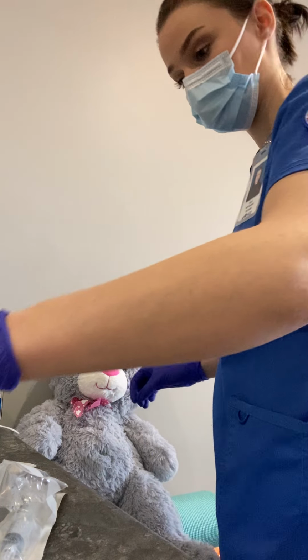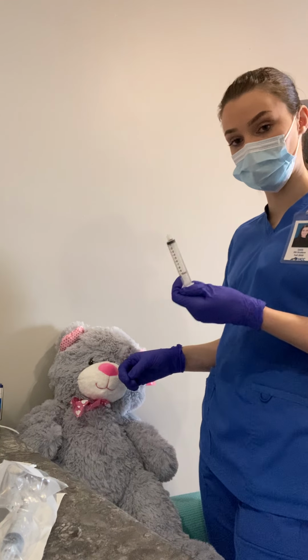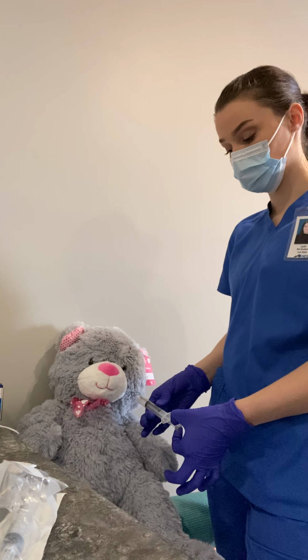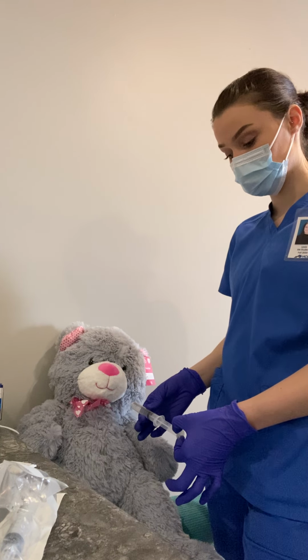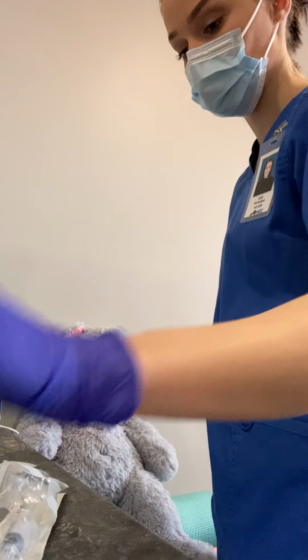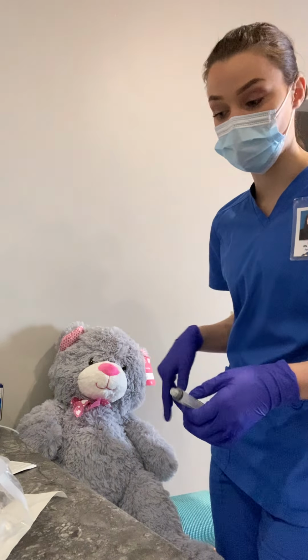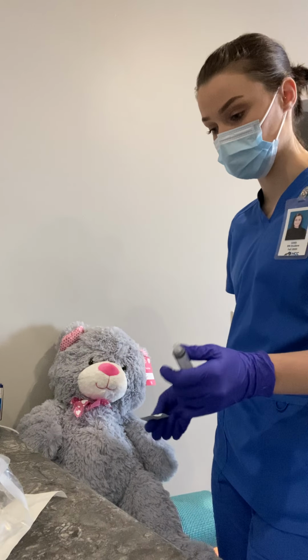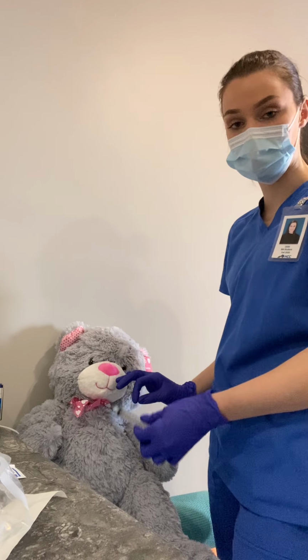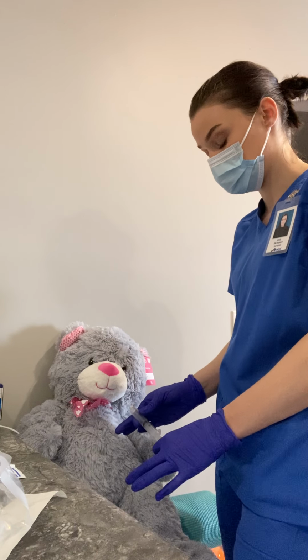Flush that. Okay. So then I'm still holding her tubing. I'm going to place my 10 ml syringe and pull back 10 milliliters of waste. All right. I've got my 10 milliliters of waste. I'm going to discard of that per my facility policy. I've got my other syringe. Oh, I just let go of my tubing, so I'm going to go ahead and scrub the hub again with my alcohol. Okay, so I've got this on. This is going to be for my blood sample, so I'm going to pull back 10 mLs or however much I need for that.